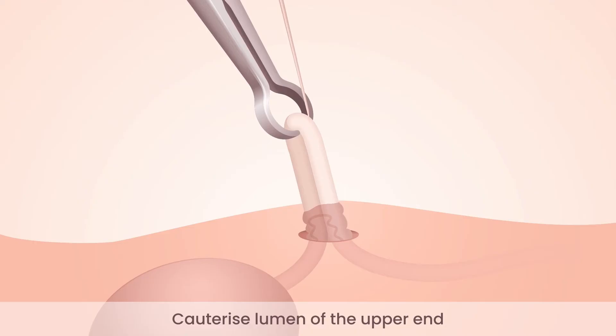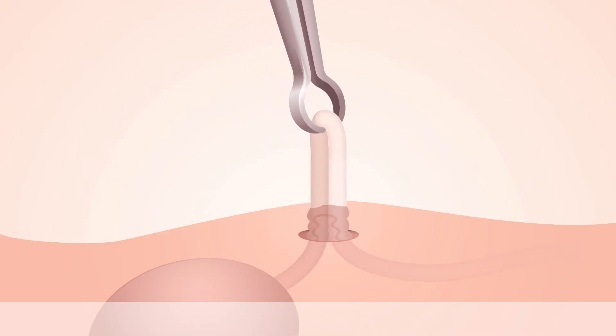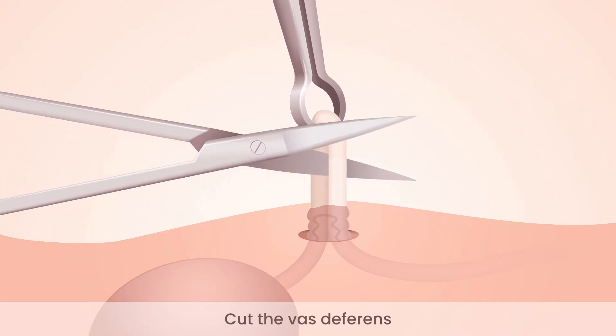Insert a fine needle electrode into the lumen of the abdominal end of the vas deferens and cauterize the lumen as the needle is withdrawn. Cut the tube.